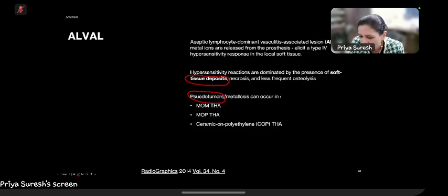Before they used to say use ultrasound and you can see maybe posteriorly, but you'll look posteriorly. But it really depends on the habitus of the patient. So I would rather do MR to get a complete picture of where the pseudotumors are.